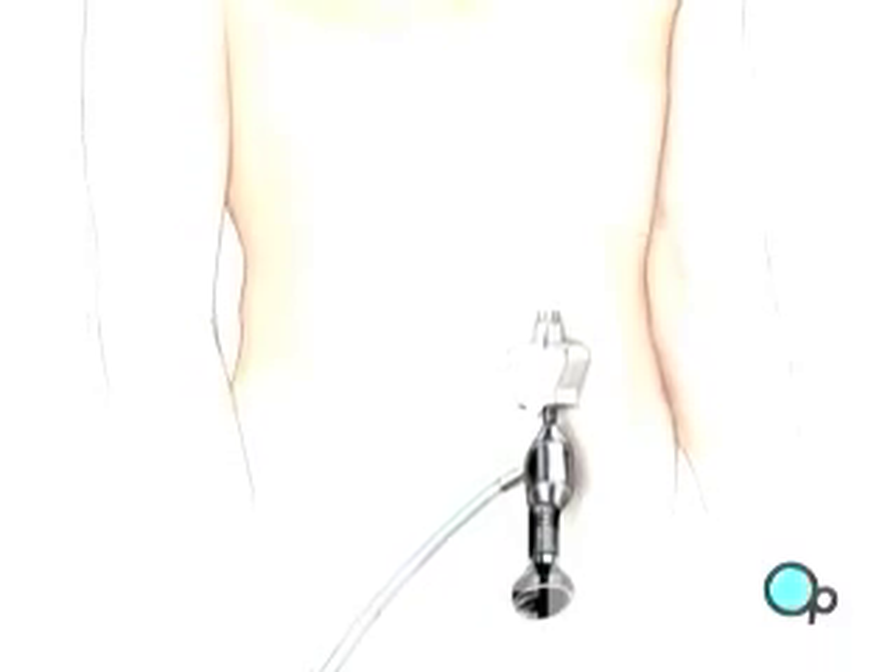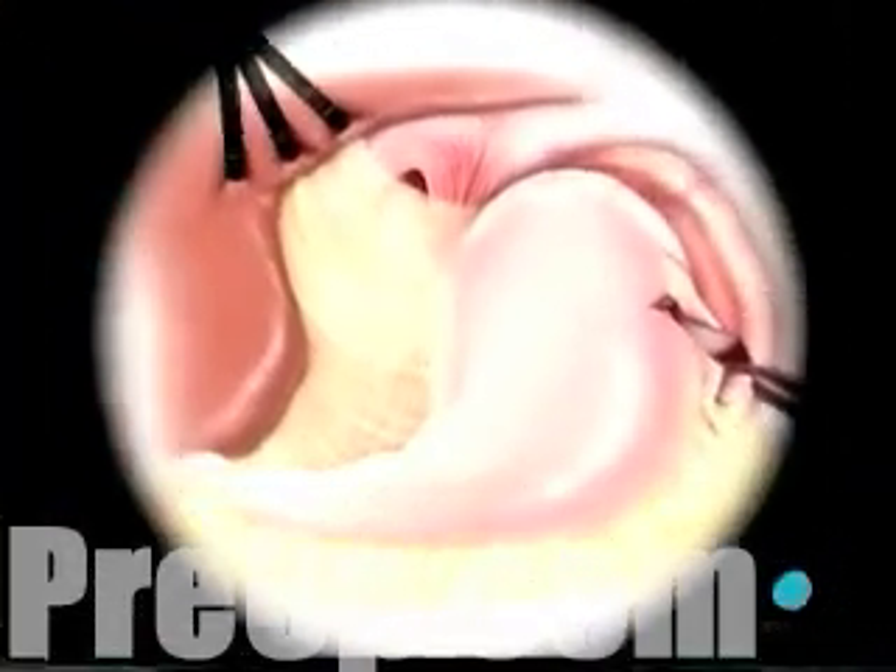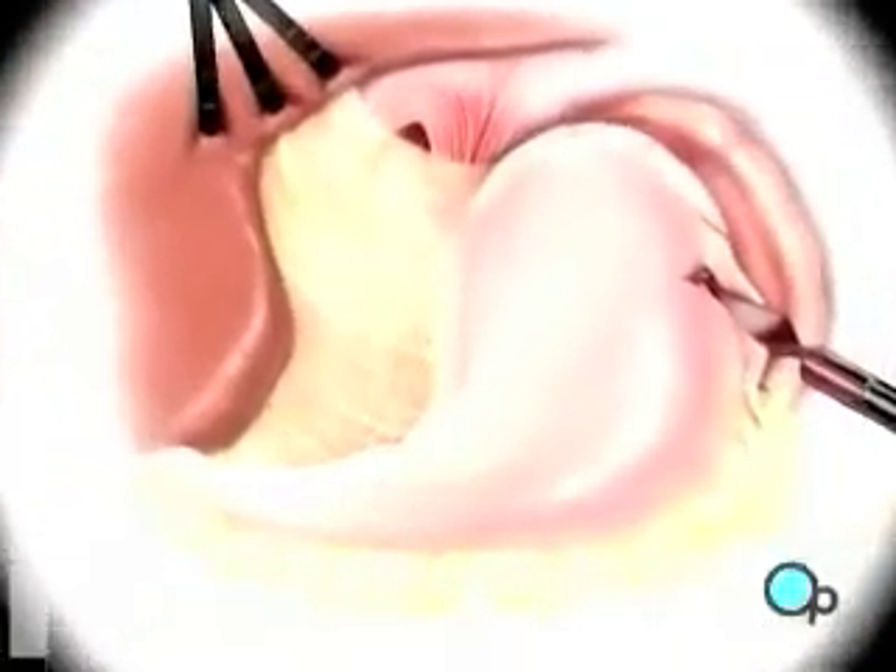Once in place, the laparoscope will provide video images so the surgeon can insert the instruments used to locate and pull back the liver in order to see the upper part of the stomach.